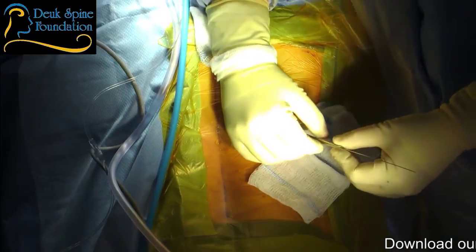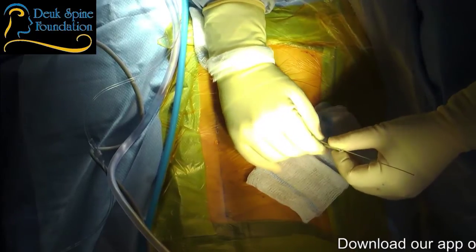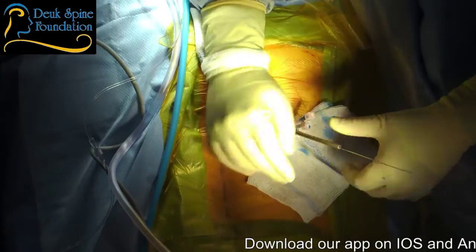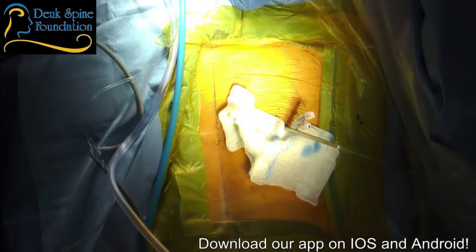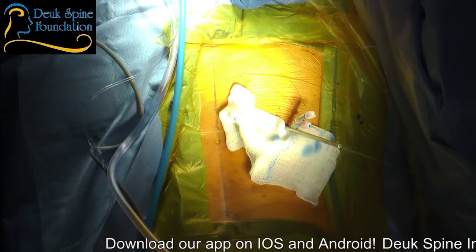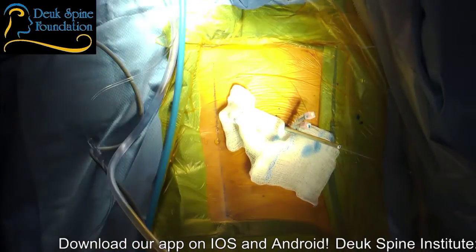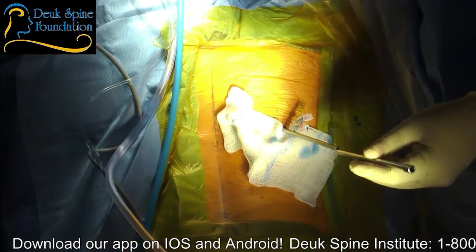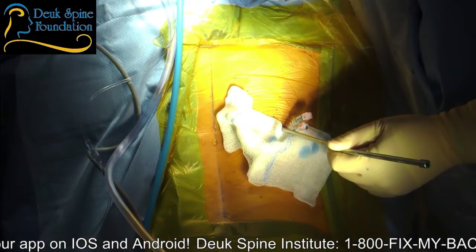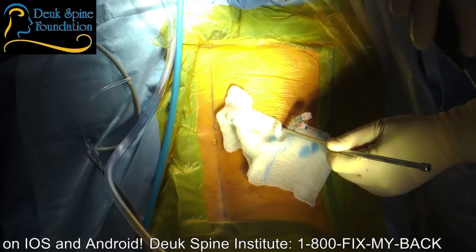So, most important point, annular tear is the source of back pain or neck pain if it's a cervical herniation. And the annular tear must be debrided to get rid of their back pain. And that's what the Deuk laser disc repair is, the only surgery in the world that debrides the annular tear. This is the year 2019. I've been doing this surgery for 13 years. And for 13 years, it's been the only surgery.